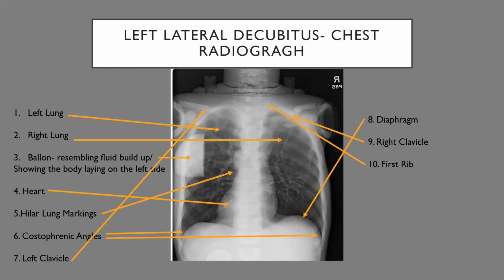Pathology best demonstrated in clinical indications. You will be able to locate the pleural effusions, demonstrated as air fluid levels in the pleural space. You can also locate possible pneumothorax if there are any small amounts of air in the pleural cavity.